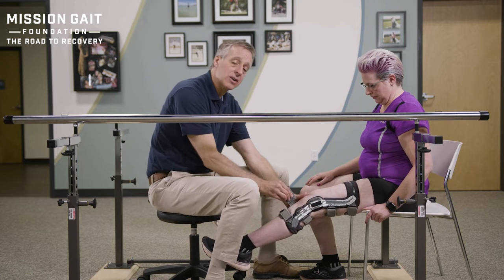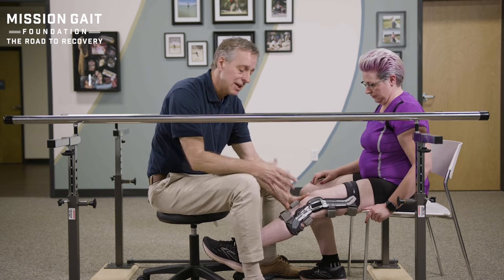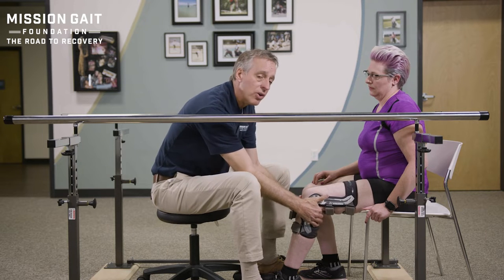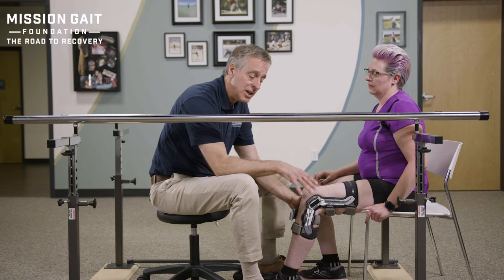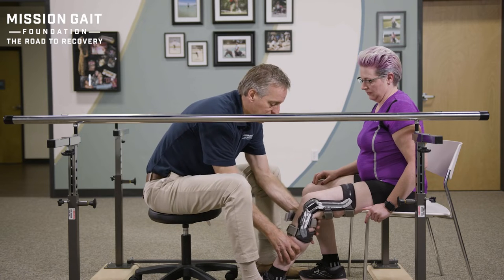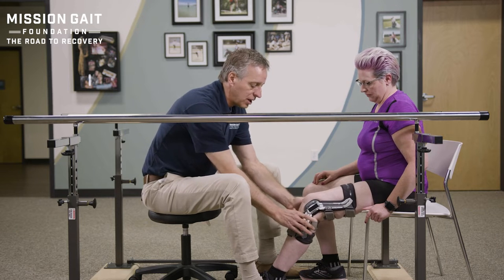Then I come to what I like to call the money strap. This strap right below the knee is where I'm going to put compression that's going to both hold the brace up and give it stabilization to the knee. One other thing important for a patient to understand — this back strap here is going to stabilize and hold on the top of her calf. If this strap is down on the calf, the brace is going to slip down. You want it right up into the crease of the back of her knee — not pinching, but snug in that crease.